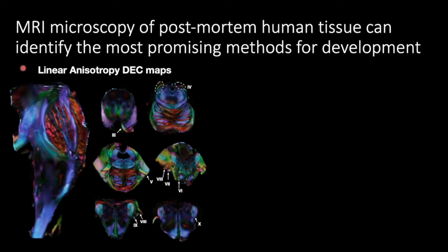And I've been involved in these types of experiments for quite a long time, including some very nice brainstem studies that I started with Carlo, just in the normal brainstem, and also in cranial nerve disorders. We're able to use the advantages of ex vivo MRI and combine it with diffusion to map out very small structures like the cranial nerves, as well as their nuclei.